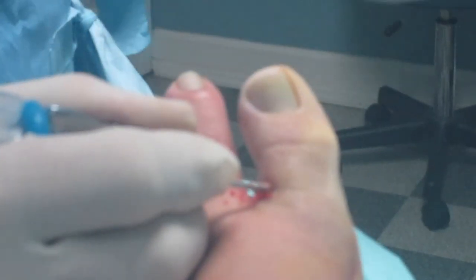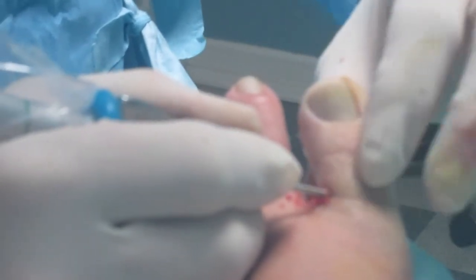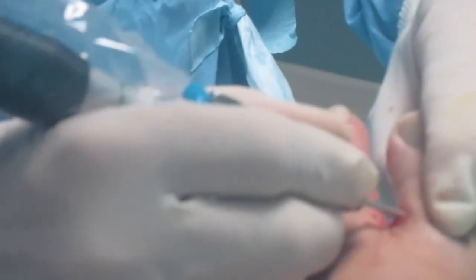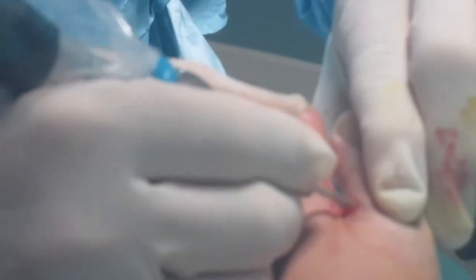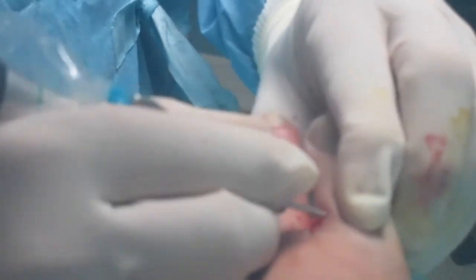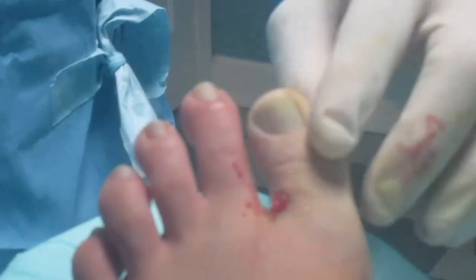At this point, I've got my cut through, but I've got this medial dorsal intact. I'm going to basically use my other hand to push the toe where I want it, and that will remove some of the lateral cortex. Once again, you don't have to go real fast with the burr. Let the burr do the work. You can just take your time into the soft tissue. You can actually feel it with your finger. So now what I've got is a little cortex intact on the medial side with a wedge plantarly. And now you can see the toe starting to take on a more normal position, so we don't get that hump out of the toe as well.